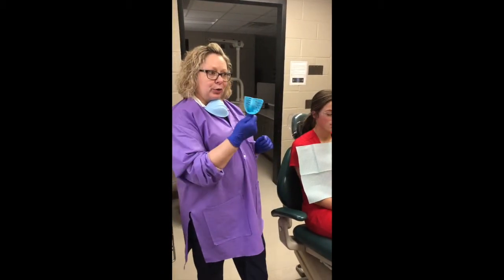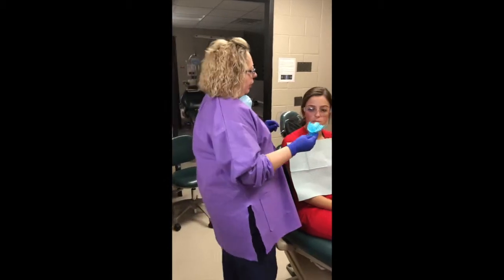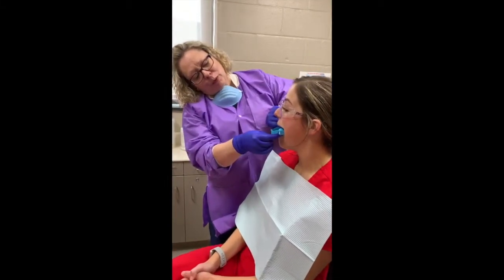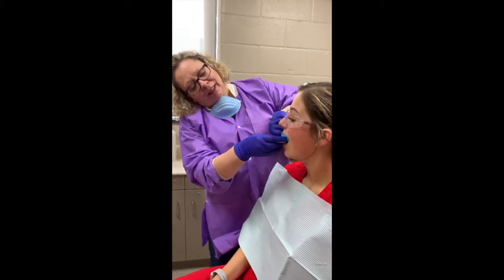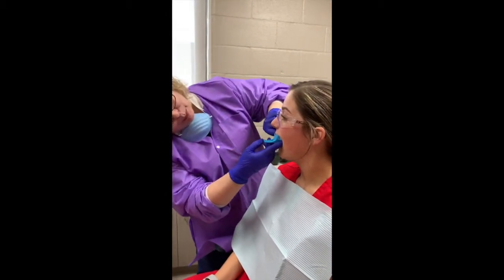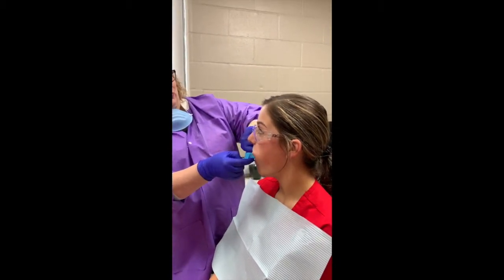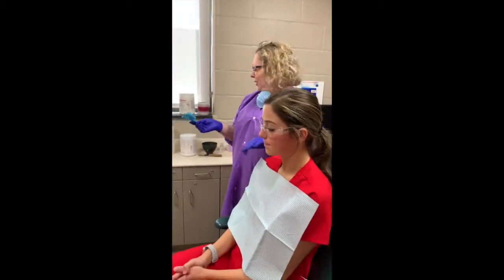So the first thing we're going to do is to ensure that we have the correct size tray. We're going to try it in. So I'm just going to pull her cheeks to the side and slip it in, and I'm going to make sure I've got all the molars, everything fits in there well. Okay, so we know that this is the right size tray.